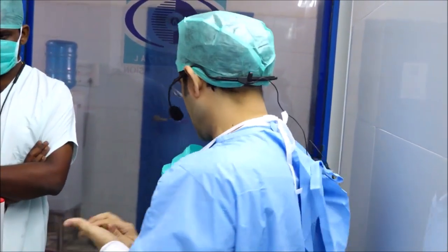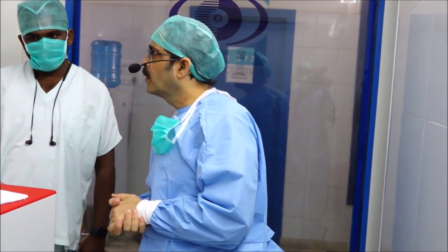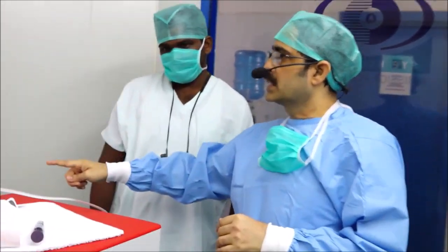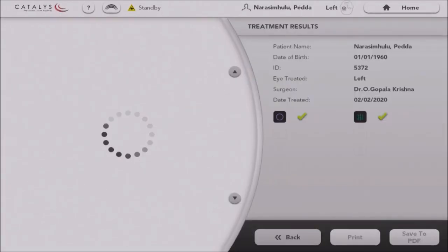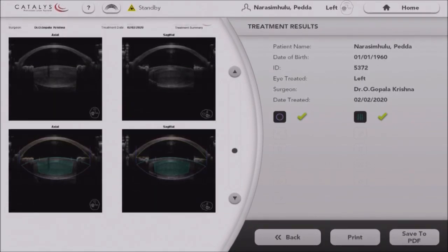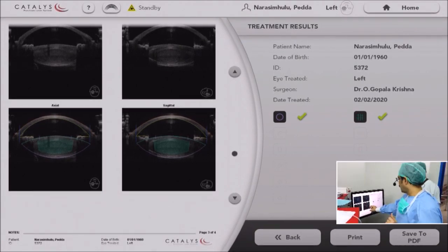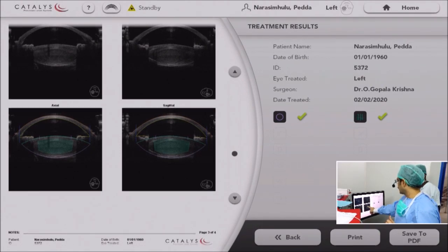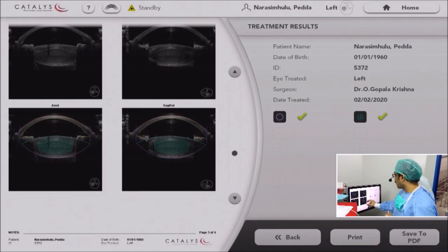You showed the OCT picture before doing the capsulotomy and laser fragmentation — can we see the same picture after doing the capsulotomy and nuclear fragmentation, so that the depth of the crack can be seen? The first OCT itself will show you the entire grid pattern. I kept a 750 micron difference from the posterior capsule, so I know pretty well that laser delivery will be in the central zone only. The entire green area marked on screen is the only area where the laser is going to be fired. There is a 500 micron clear zone from the entire anterior capsule and a 750 micron clear zone from the posterior capsule. In the central area only, the lens will be fragmented.